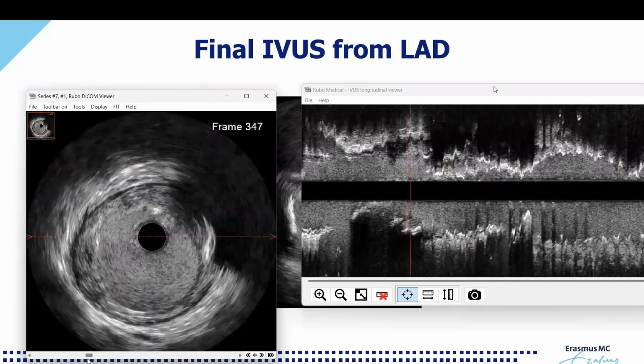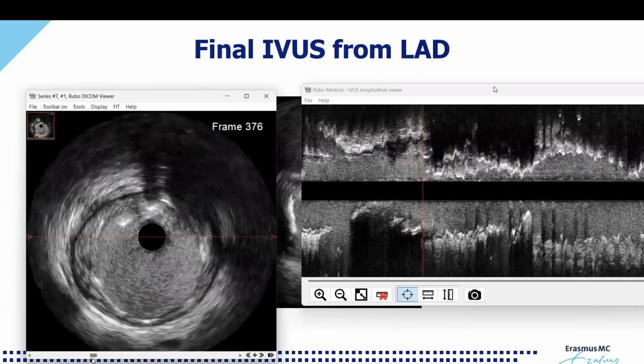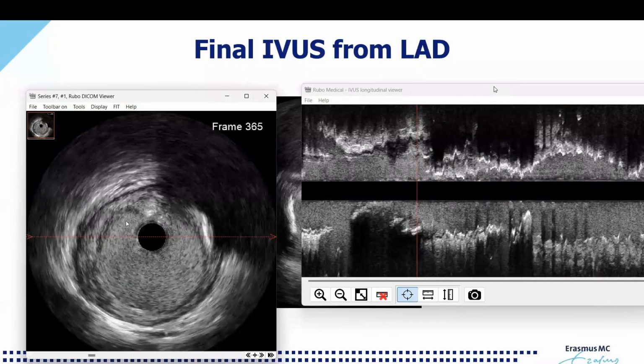And of course, we checked. You have to check in here. Here's the edge of the stent, and you see here. I dare say that we have less than 50. Yeah, I tend to agree. Yeah, you see. So this is okay.